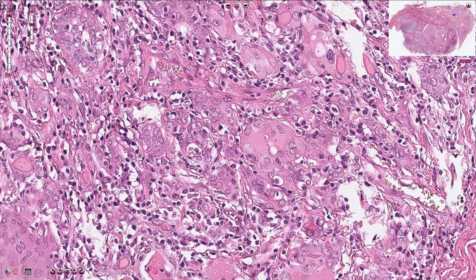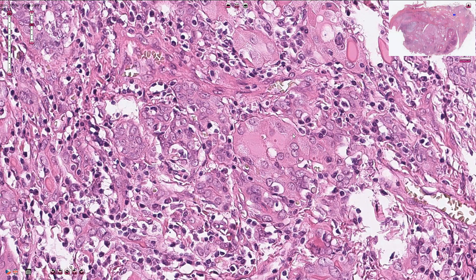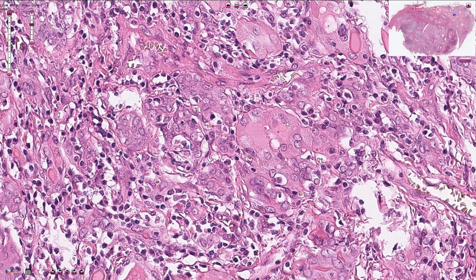Here we can see the typical transformation of thyroid cells. These cells have more voluminous cytoplasm with an eosinophilic and granular appearance. This granular appearance is caused by high mitochondrial content in the cytoplasm — this is called oncocytic change. These cells are also called oncocytes, or in this context, Hürthle cells.